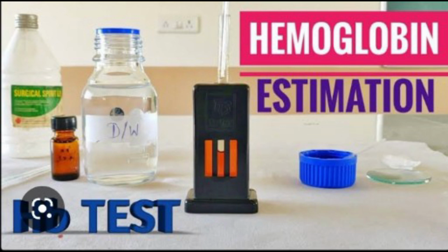Specific gravity method. Principle: when a drop of whole blood is dropped into copper sulfate solution with a particular specific gravity, the density of the drop is directly proportional to the amount of hemoglobin in the drop. If the drop is denser than the specific gravity of the solution, the drop settles down to the bottom. If not, it will float on the top.